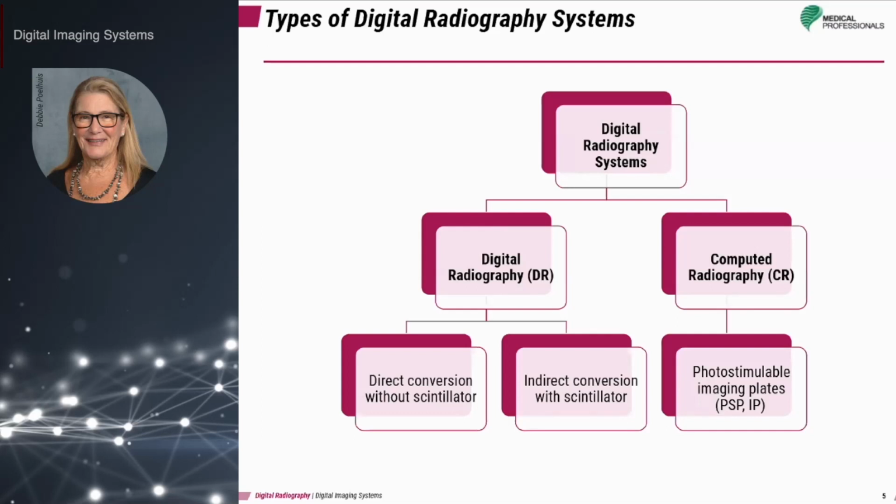Digital, or DR, on the other hand, usually refers to an image receptor that may be inside of a device that bears some resemblance to a traditional cassette, or the image receptor may be part of the X-ray equipment itself and never handled by the radiographer. In either case, once the exposure is taken, the image data is sent to the computer, and the image receptor is immediately ready for the next exposure.